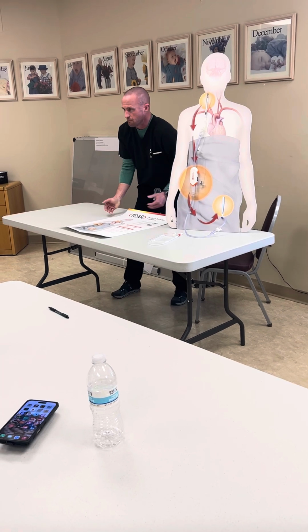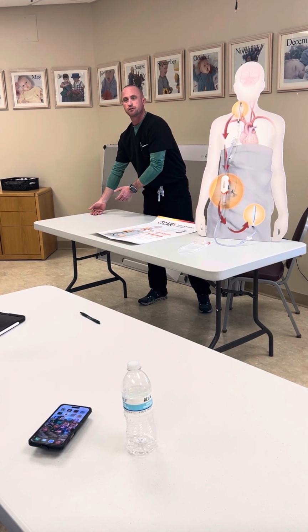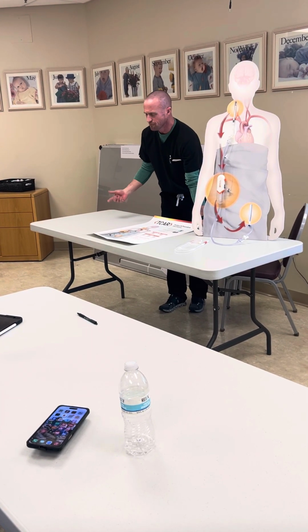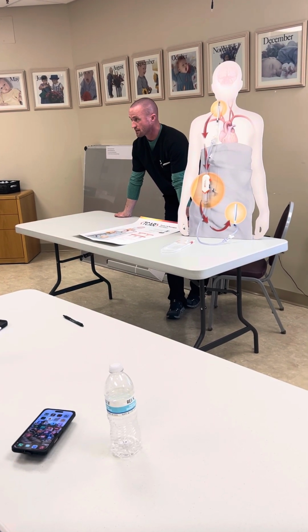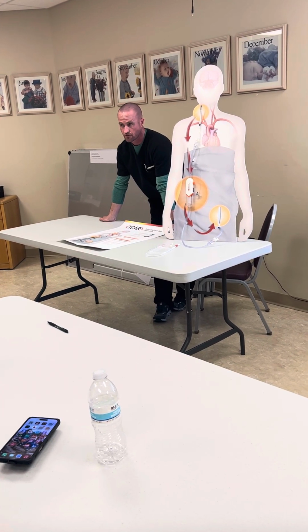And it just speeds up the case, and you may not post-dilate if you needed to, you may not spend as much time looking at the stent as you might need to be sure that everything's fine. And I think that causes a little undue stress. But knock on wood, it's a great case. It's fun. They're all pretty effortless.